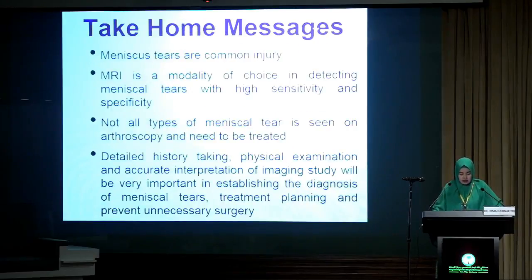Take-home message for this topic: meniscus tears are a common injury. MRI is the modality of choice in detecting meniscal tears, with high sensitivity and specificity. Not all types of meniscal tear are seen on arthroscopy and need to be treated.